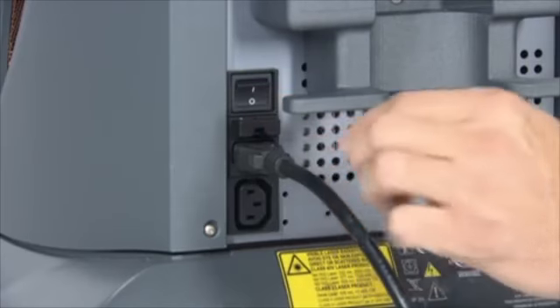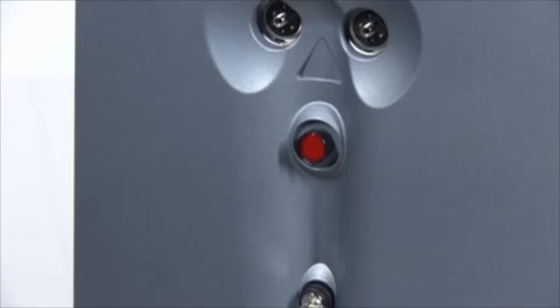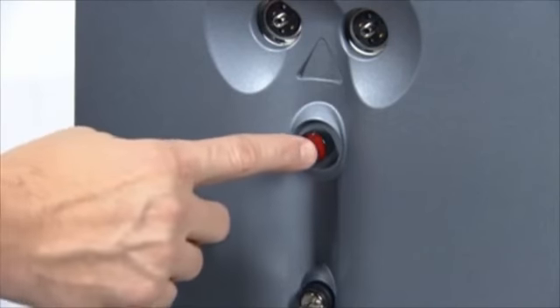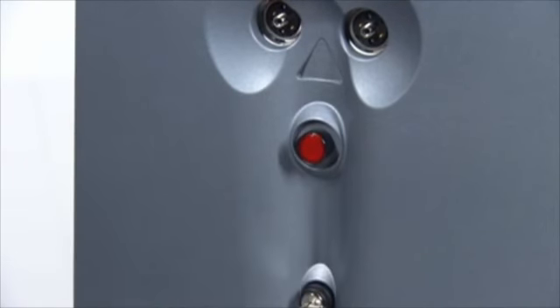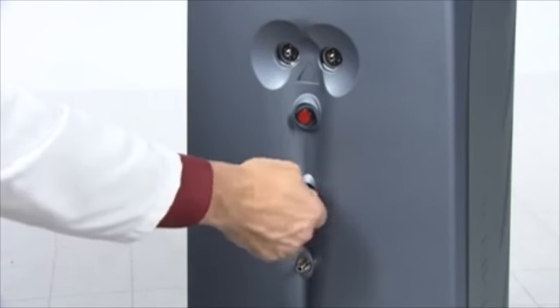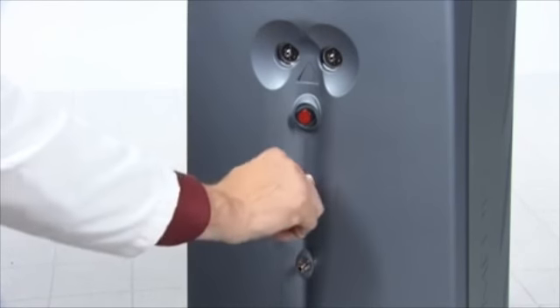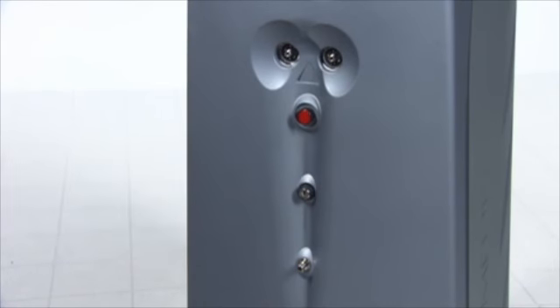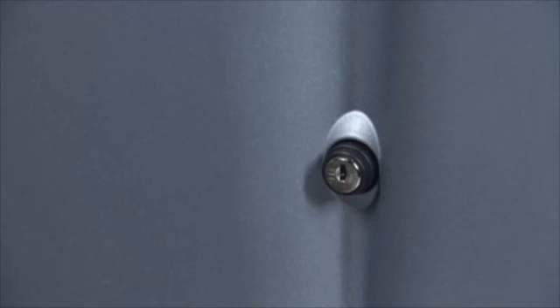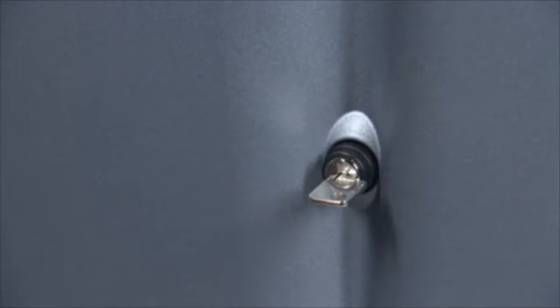Make sure the laser is completely shut down before inspecting any delivery system or laser components. The laser has an emergency off push button, which immediately turns off the laser. To prevent unauthorized use, the laser can only be turned on with the master key. The key can only be removed when the laser is turned off, and the laser only operates when the key is inserted into the key switch. When the key switch is turned to the on position, the laser power-up sequence is initiated.